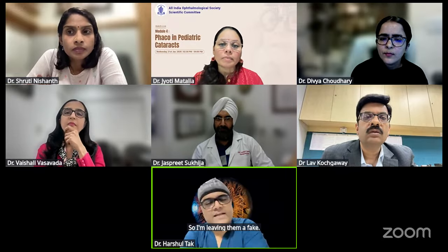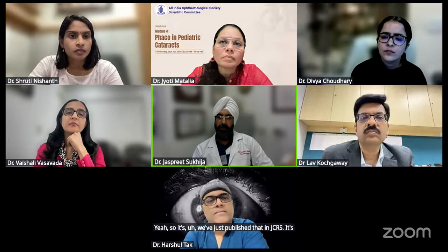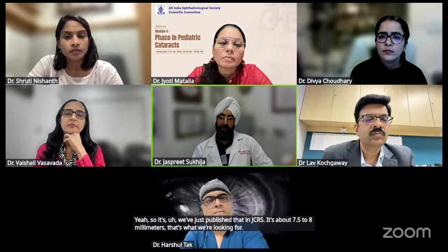So what is the bag size you look for, Jaspreet? Yeah, we just published that in JCRS. It's about 7.5 to 8 millimeters. That's what we are looking for, because there is some stretchability of the bag in children. It's an elastic capsule, so probably in that size you can do it.